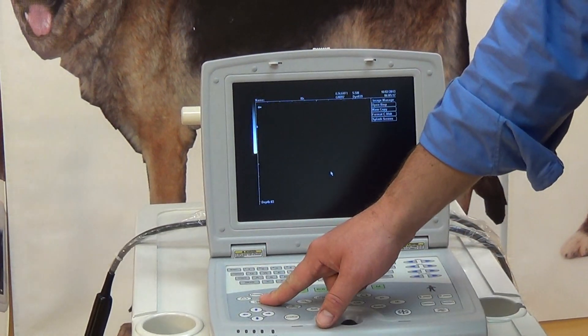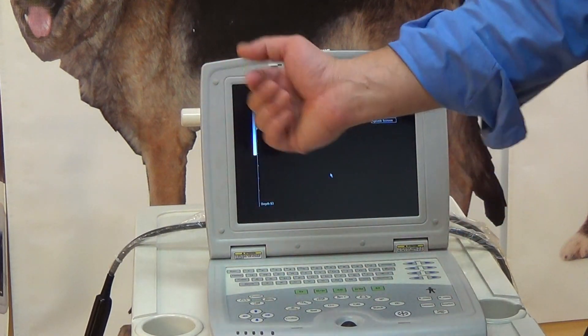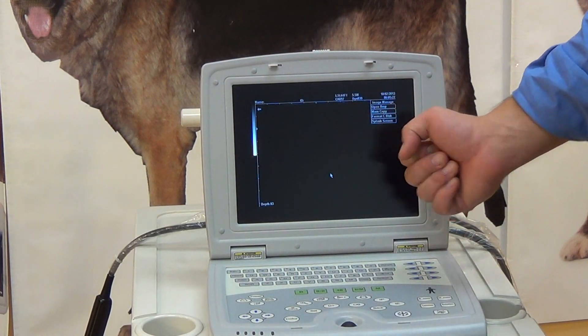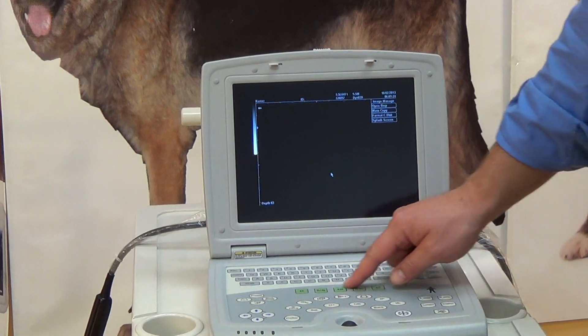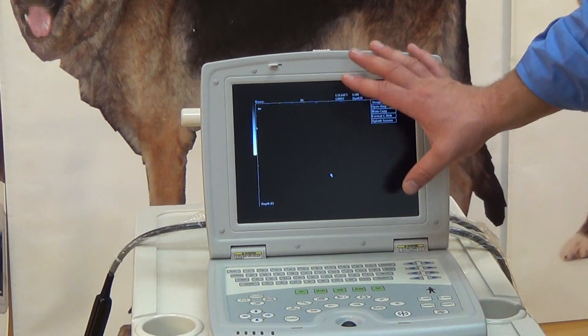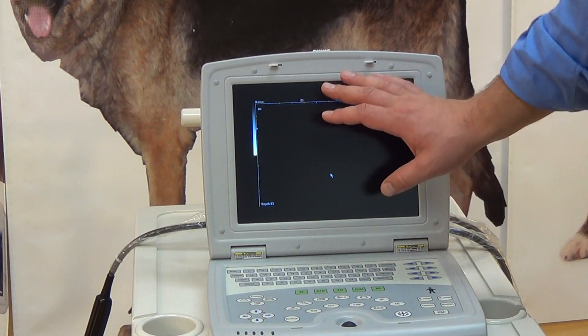Then we have a cine button, which once you have several images, you can loop through what you've frozen. Going towards the middle of the screen, we have our different modes. So B mode is your standard image mode. That's what's always on the screen, just one screen.